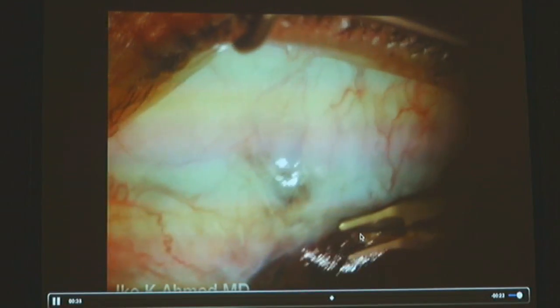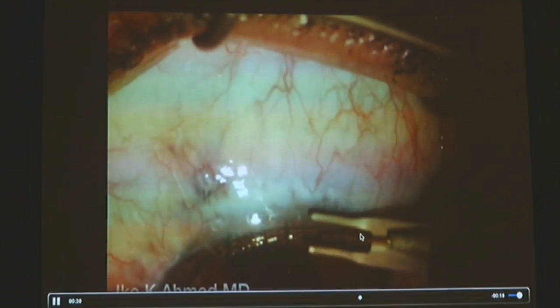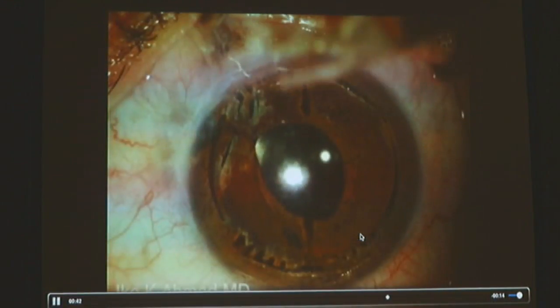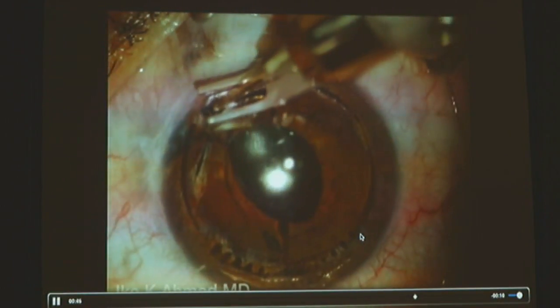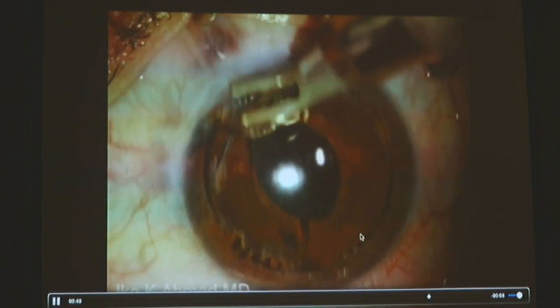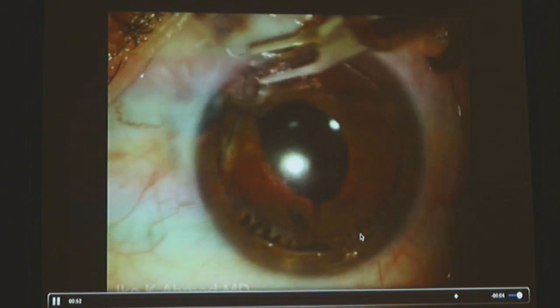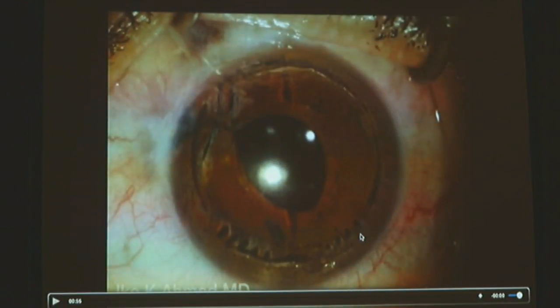But anybody, again, any of us treating astigmatism will always have some patients who come back who have residual astigmatism that we need to treat. And instead of taking them to the OR or doing femto laser or rotating the IOL, this is a very useful technique. And I have the special blade here that we use. It's a diamond blade that we can nicely use to create these curvilinear arcs.